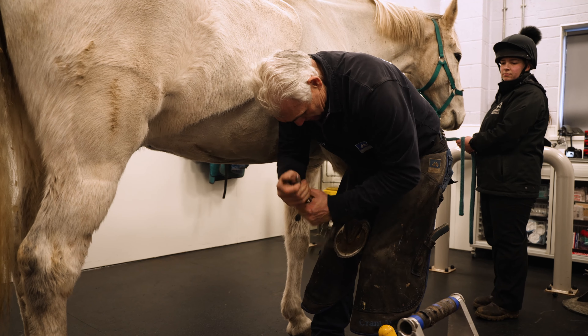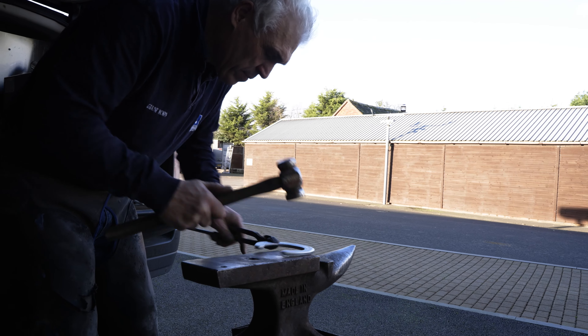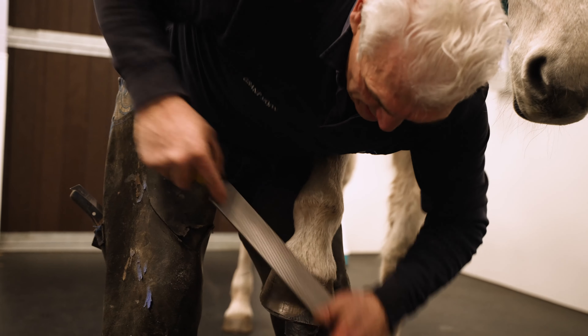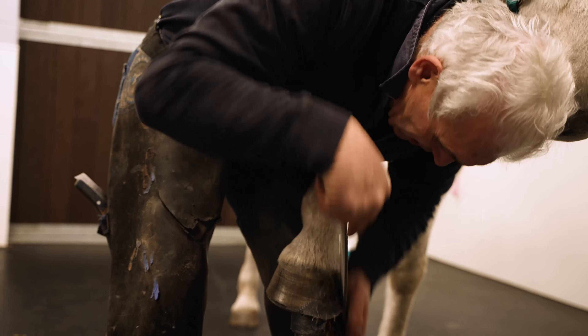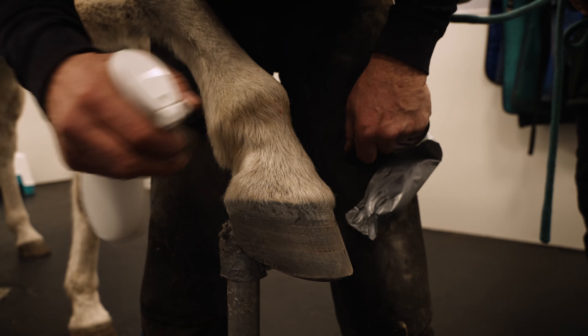To use the Mustad HoofCast, prepare the hoof as normal and fit the shoe or plate to shape, allowing for the additional thickness of the casting tape. Prepare the outer hoof wall with a rasp, sanding block, or buffer. We recommend using denatured alcohol to clean the hoof wall.